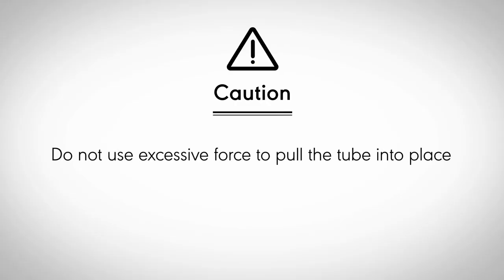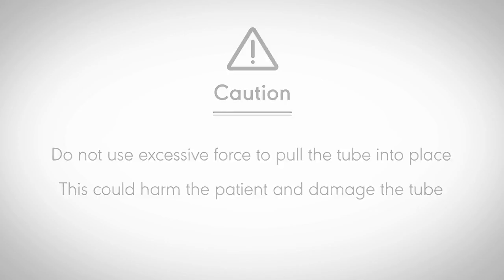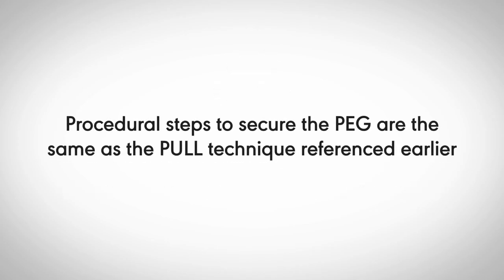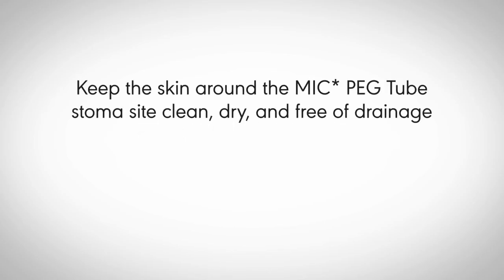Caution: do not use excessive force to pull the tube into place. This could harm the patient and damage the tube. Procedural steps to secure the PEG are the same as the pull technique referenced earlier. Keep the skin around the MIC-PEG tube stoma site clean, dry, and free of drainage.